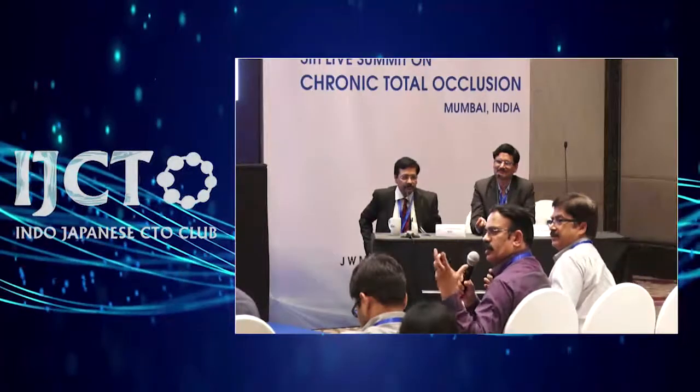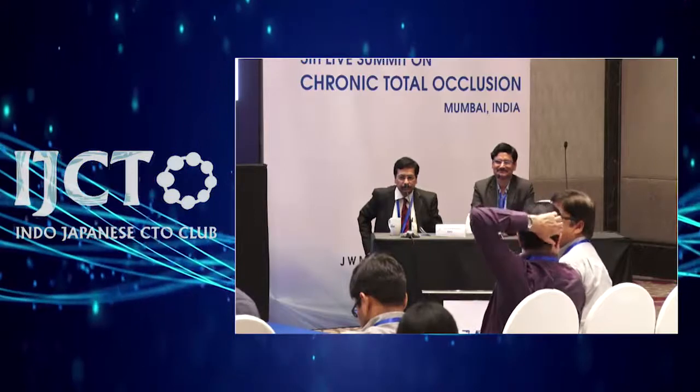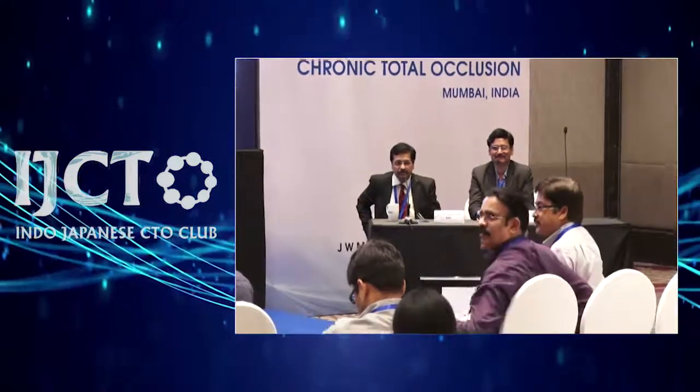What was the balloon? It was from Bolton Medical, a company called Bolton Medical. We lost that balloon. It was like a centering balloon. There is a system of a centering balloon which keeps your microcatheter in the center, coaxial to the artery, so you will reach there. But right now there is a new device available, a centering balloon system, which is not with us, but I have seen it in one of the recent meetings somewhere. It is a centering system, and that is a part of the support systems. So something like that could be there.